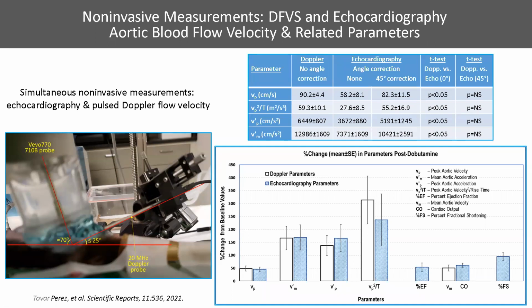There are some institutions where people have to wait in queue to get their measurements done. These measurements take a longer time. And as you can see, you have to place a lot of gel on the animal. You're kind of changing the physiology, in addition to cooling the animal and things like that. Of course, even if you use warm gel, sometimes you still have those effects in place.